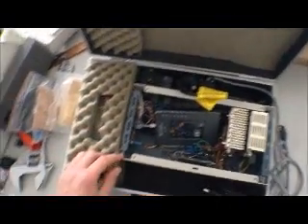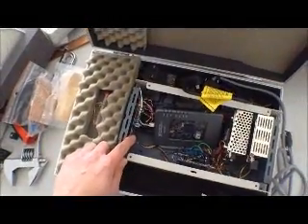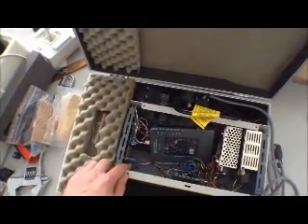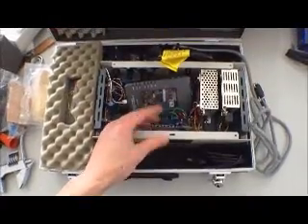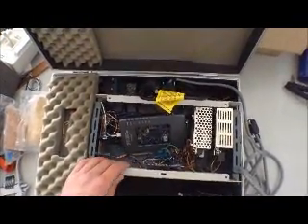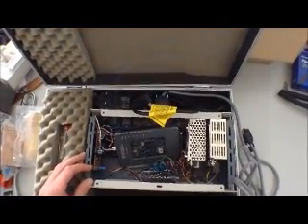There's an amplifier within the system, which is here. This allows us to get actual usable values from the RTDs, since the RTDs are so small. There's an LCD screen which can be programmed later on to show results to the physicians rather than them reading off a screen. It allows patients to see as well if applied in a clinical environment.